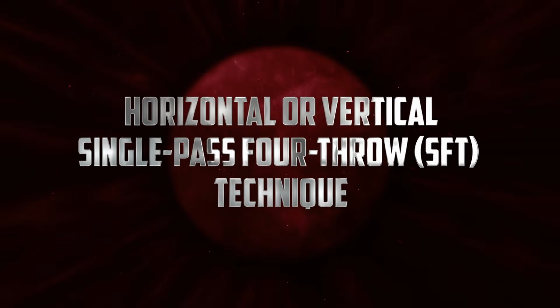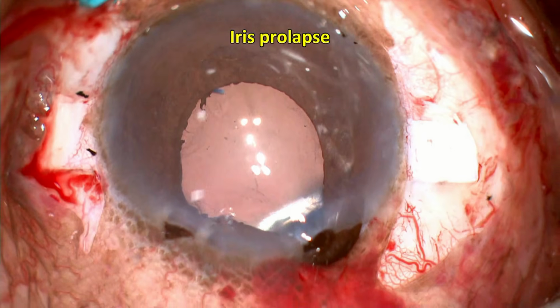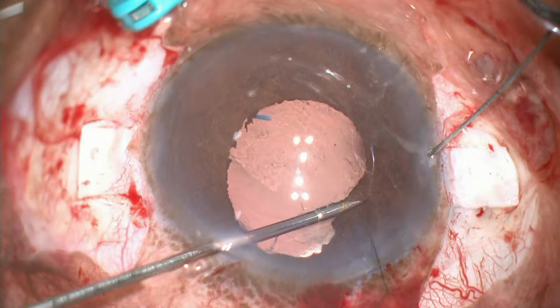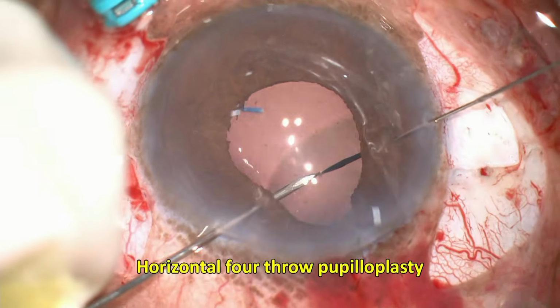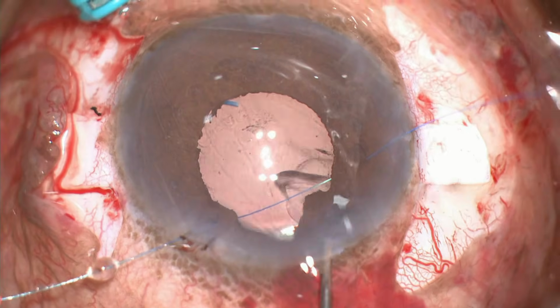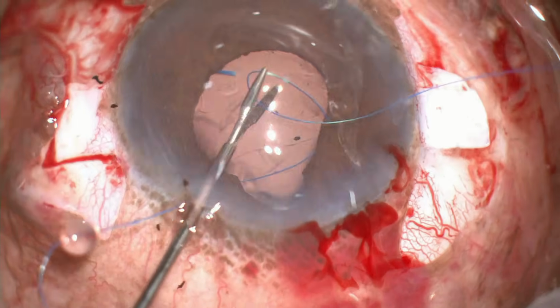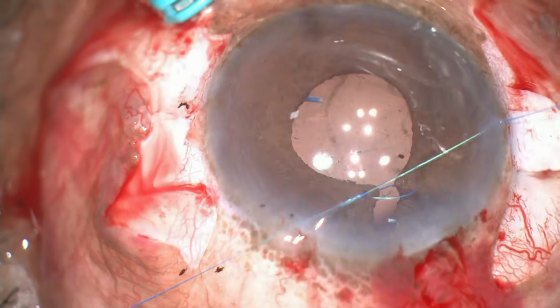Horizontal or vertical single-pass four-throw technique. The floppy iris and its constant billowing into the corneal incision is a surgical challenge. Now, the iris tissue in floppy iris behaves differently compared to normal tissue. Usually, the surgeons perform a horizontal iris repair wherein the 9-0 Prolene suture imbibes the atonic iris both proximally and distally. And this tissue has the tendency to get drawn towards the corneal wound.